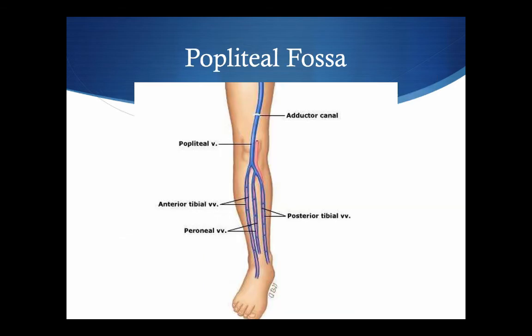until I lose it in the adductor canal. And then when you get to the popliteal, really just get right in the crease, peel back layers, apply some pressure, make sure you're deep enough, find the popliteal vein, and then track it proximal and distal until you see the branch points come off. And make sure everything that's not an artery is compressing. You don't have to identify that's anterior tibial, you don't have to do that. Just anything that's not an artery compresses.